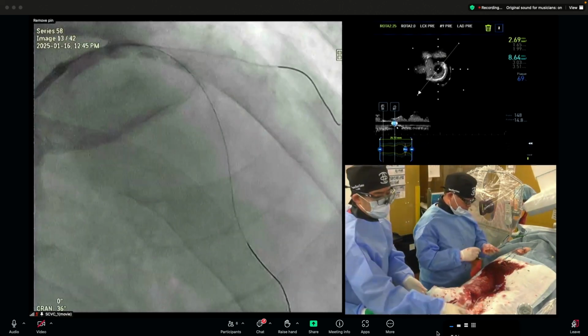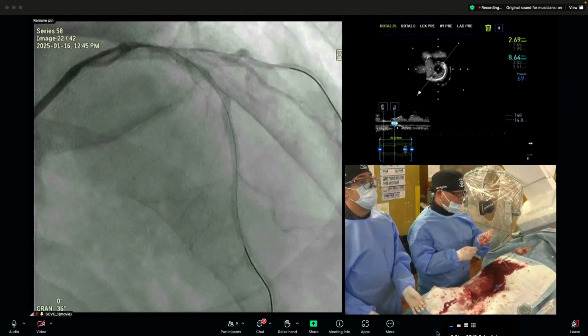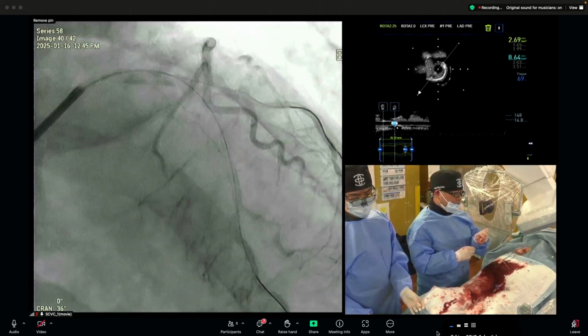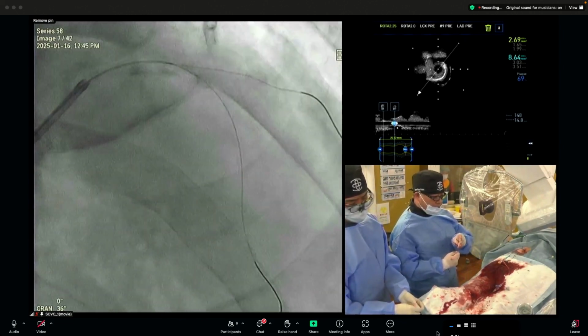How about after atherectomy? You see the imaging, and then when will you consider, for example, a cutting balloon or using IVL? Because appearing from all the imaging, angiogram, IVUS, there's still a lot of calcification behind.